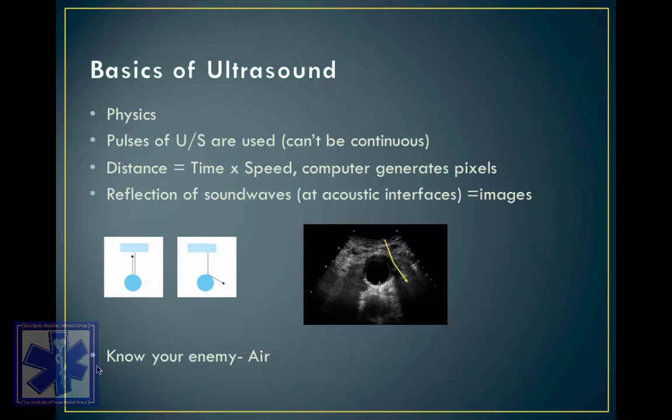Then the sound waves will come through here. That'll give you a little bit more reflection, but not much. And then it'll say, hey, there's nothing there. And then it hits the back wall and bounces back. And then your computer generates this image to show you that.